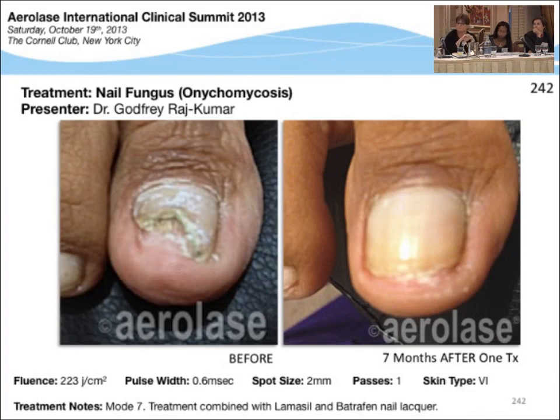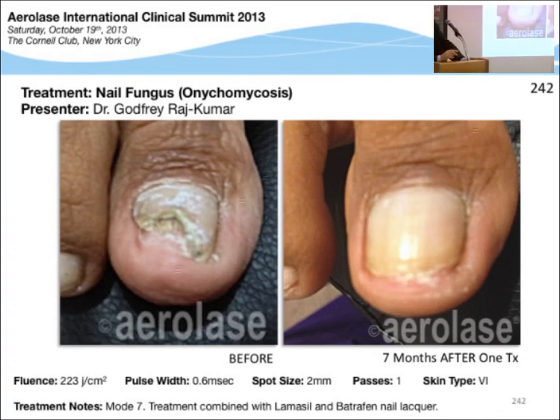Yeah, most of the time, I'm waiting sometimes up to 6 weeks. Sometimes it'll be very interesting. We get the three different results microscopically, PAS and KOH, and sometimes the first two will be negative, and the third one is positive. So it takes some time, but in the meantime, we're treating it. We start on an antifungal, we start on a lot of different things, so go from there. Let me move on here.